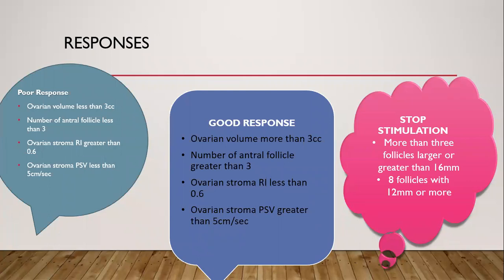And this can equally be used as a tool in the baseline to determine whether the ovarian stimulation protocol is going to be successful. In most of the cases, when you do your baseline and you realize that the ovary is as small as with that volume or less, then the possibility of getting the oocyte at ovulation is very slim.